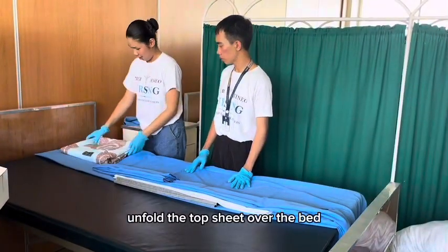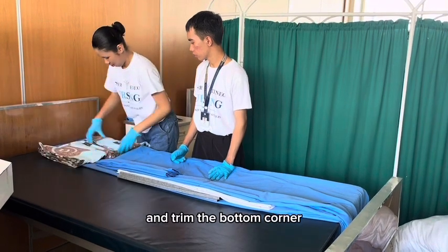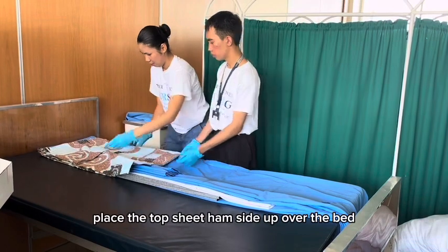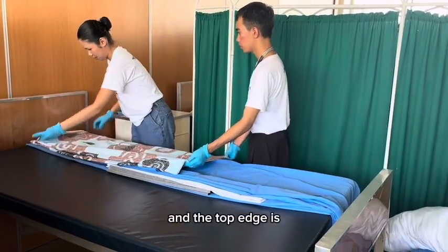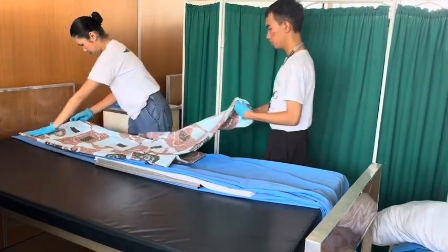Unfold the top sheet over the bed, tuck it in, and trim the bottom corner. Place the top sheet hem side up over the bed so that its center fold is in the midline of the bed and the top edge is even with the top edge of the mattress.